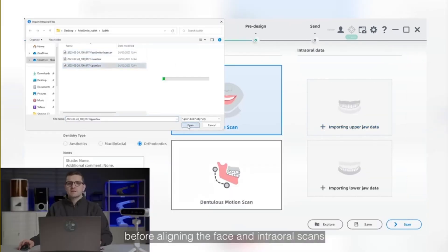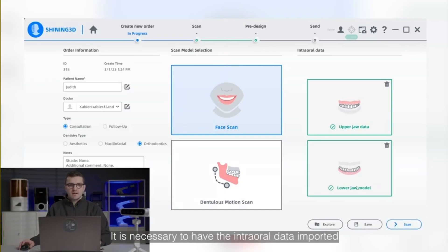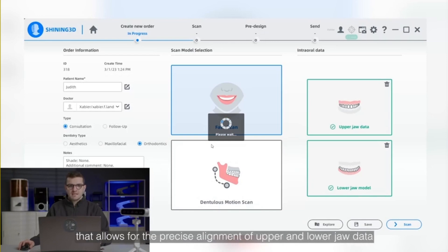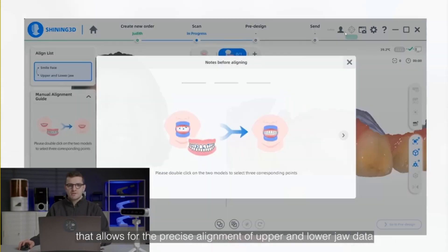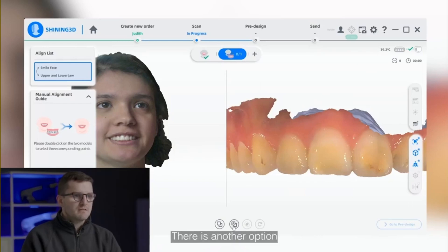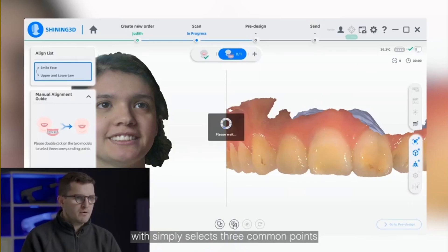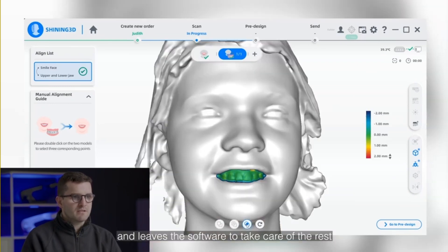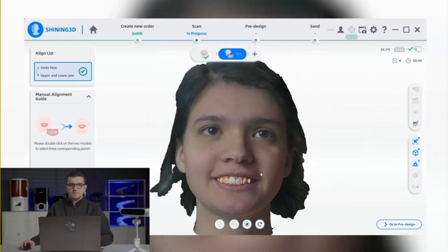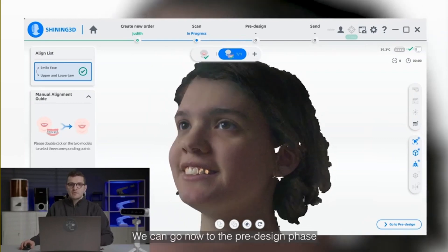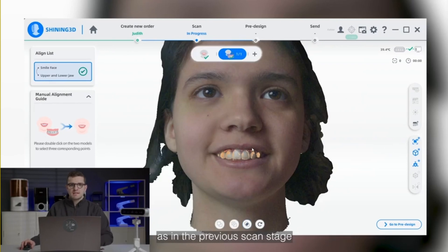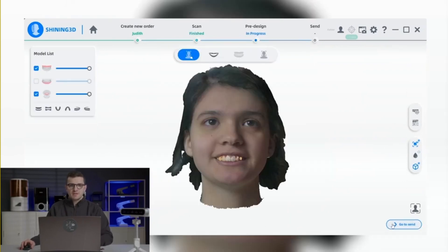Before aligning the face and intraoral scans, it is necessary to have the intraoral data imported. Our software includes an automated alignment feature that allows for the precise alignment of upper and lower jaw data. There is another option which simply selects three common points in both the face and intraoral scan models and leaves the software to take care of the rest. We can now go to the pre-design phase, where we can use exactly the same editing tools as in the previous scanning stage.